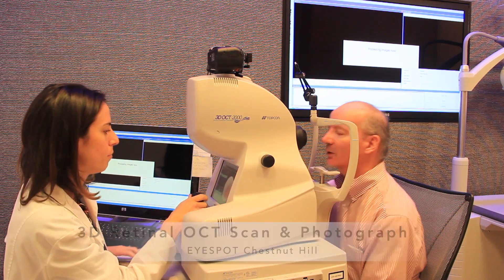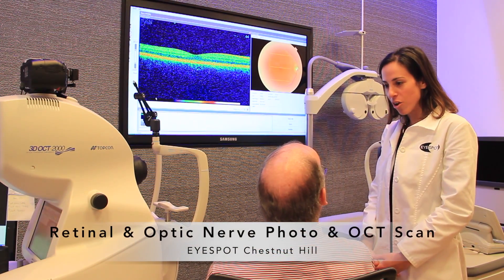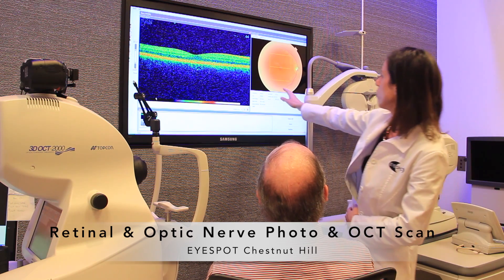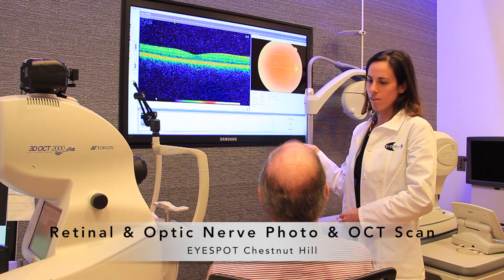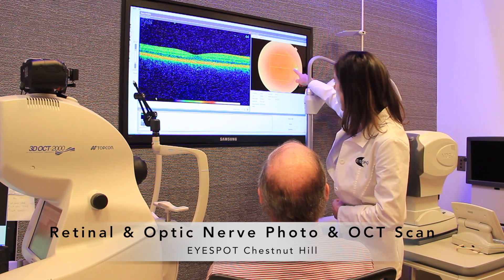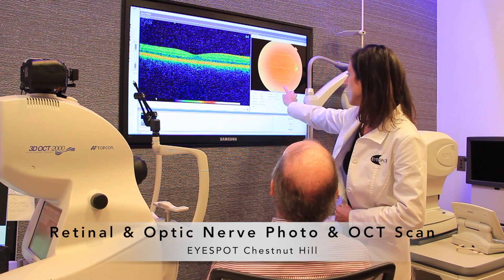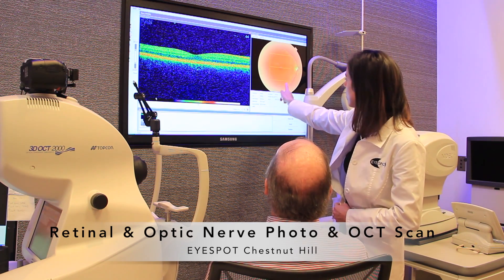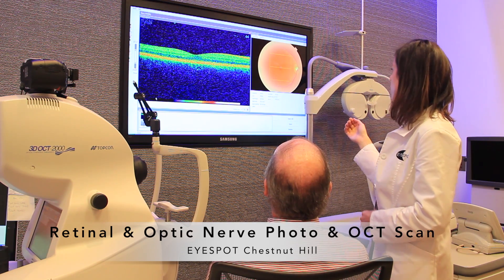Okay, and you can sit back. Let me go over your scan with you now. If you look at this photo here, this is a photograph of the back of your eye. Right here is your optic nerve and you can see the vessels coming out. The thicker ones are your veins and the thinner ones are your arteries. Everything looks healthy over there.